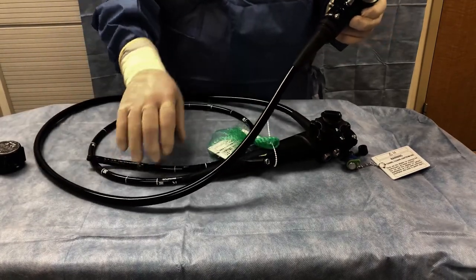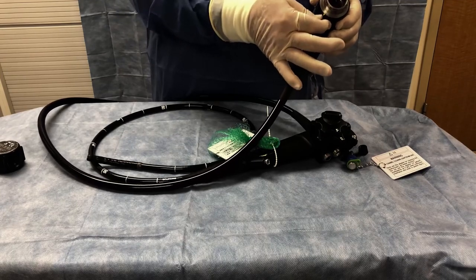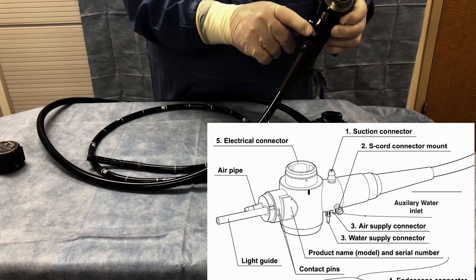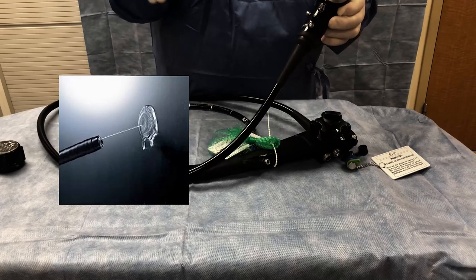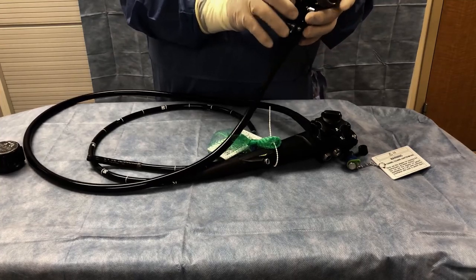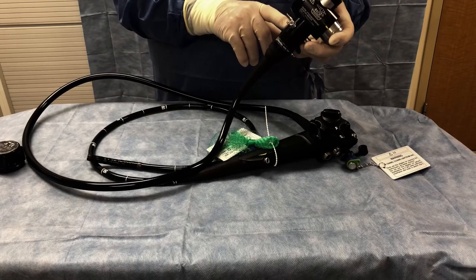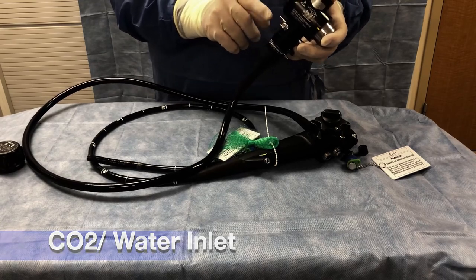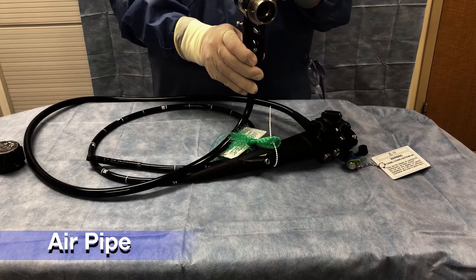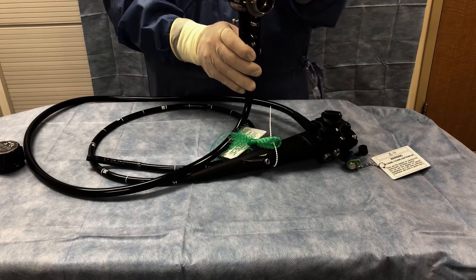The electrical connector is also where the suction hose hooks up so we can suck fluid out to a suction device. This little connector is the auxiliary water inlet, which enables us to squirt water out of the tip of the scope to clean an area we are looking at. There is also a grounding post, a connector for the CO2 and water from the water bottle and CO2 tank, and an air pipe in case we need to push air through the scope from the air pump on our light source.